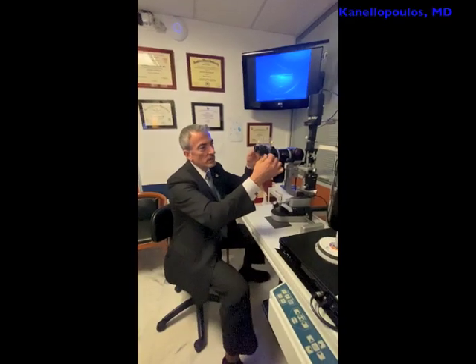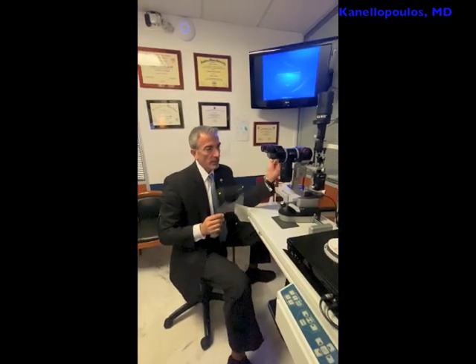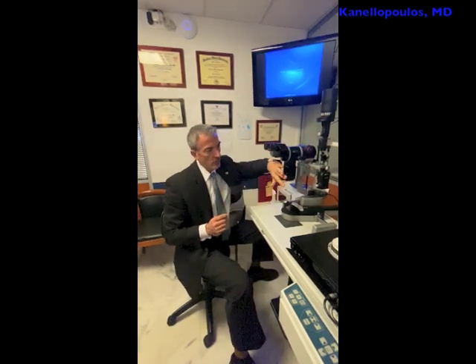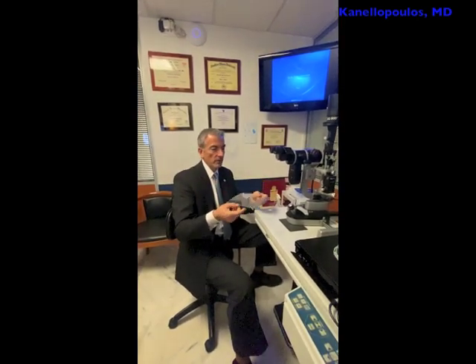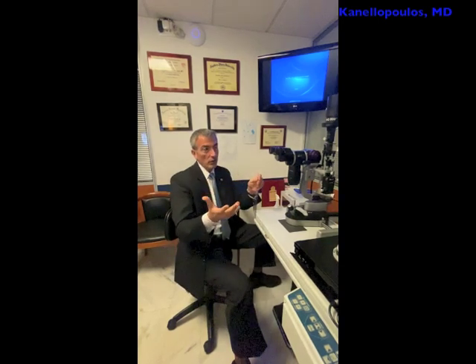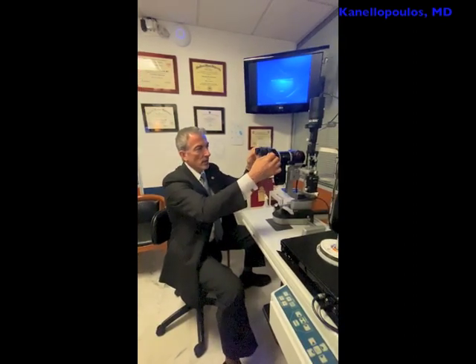Hope you found this interesting — it's extremely simple. Some slit lamps, some older models — I remember in my training in New York — used to come with a plexiglass shield between the examiner and the examinee. And this is the very flexible version, made out of just a cellophane letter size sheet you can find in any copy store. We've carved out this universal opening that will fit most — actually all — slit lamps, and we place it right over the oculars to fit right at the edge of the oculars.